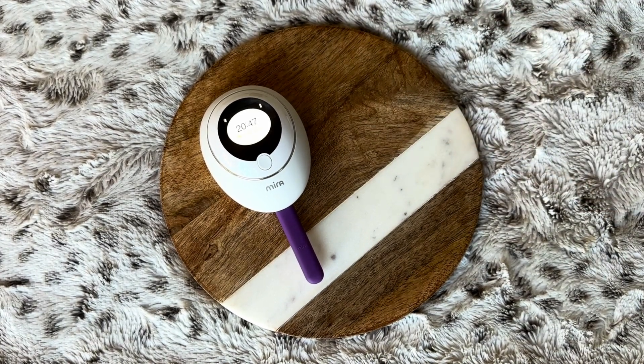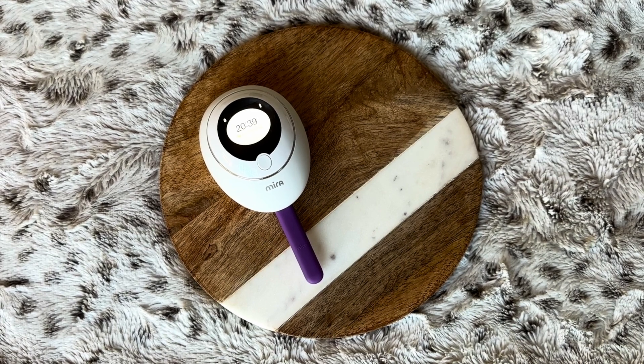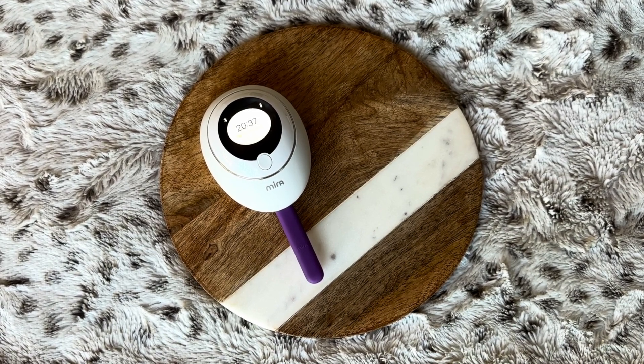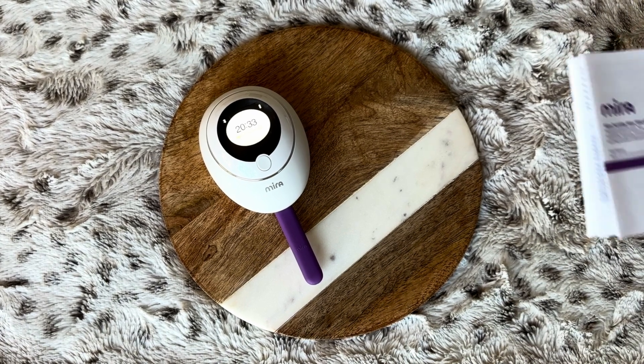Depending on which wands you use, the analyzer will process your test for 16 to 21 minutes. Once your results are ready, they will be synced and saved to your Mira app. You don't need to keep your phone close to the analyzer during this countdown.